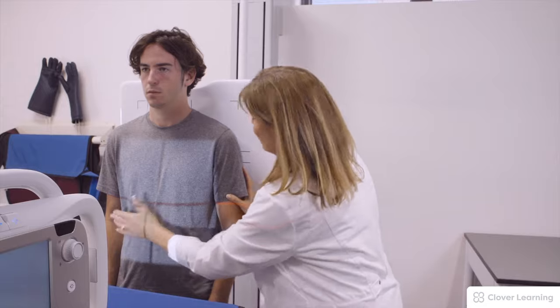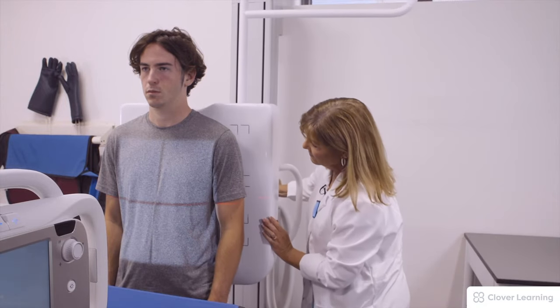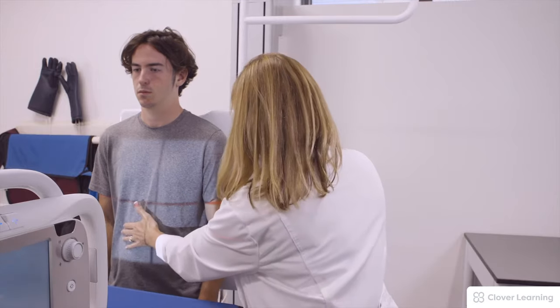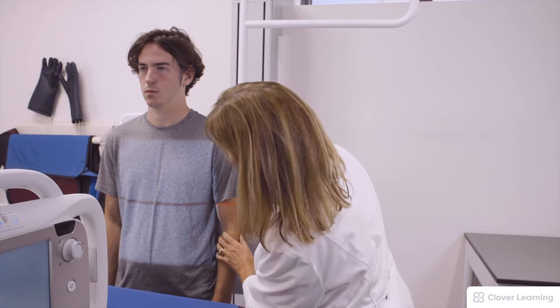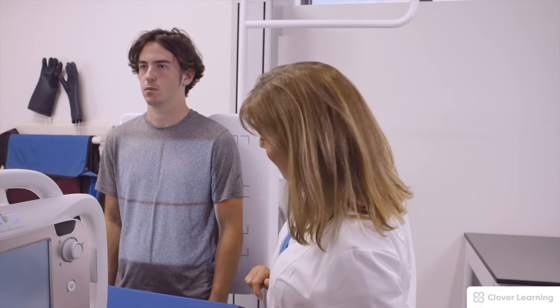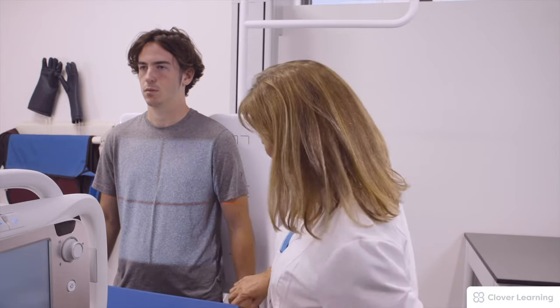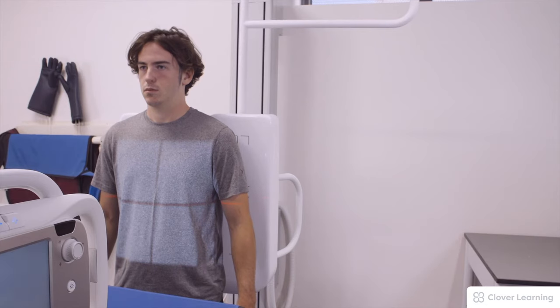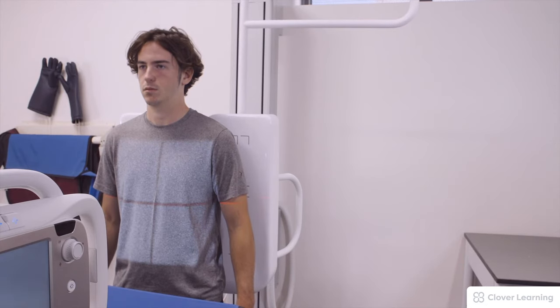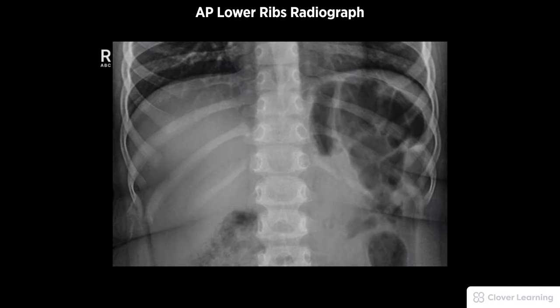We maintain the mid-sagittal plane and return the patient to the midline. For below the diaphragm, we use expiration. The patient's arms are placed out to the side. The patient takes in a big deep breath and blows all the way out, then stops breathing and the exposure is made.